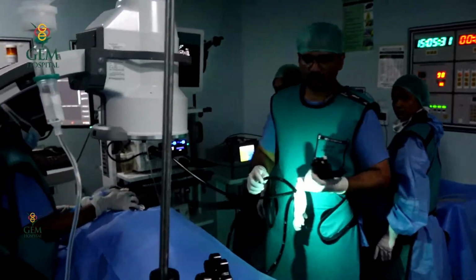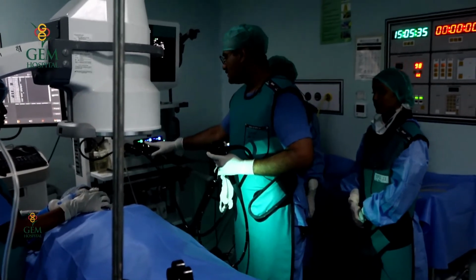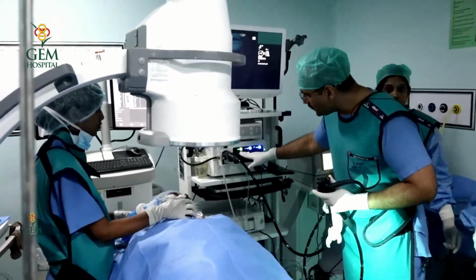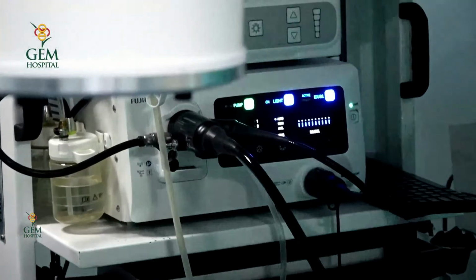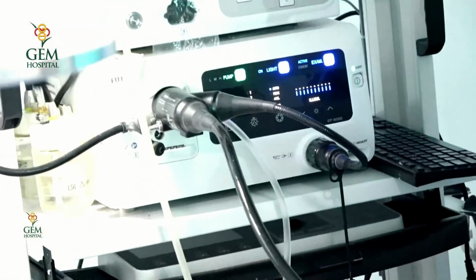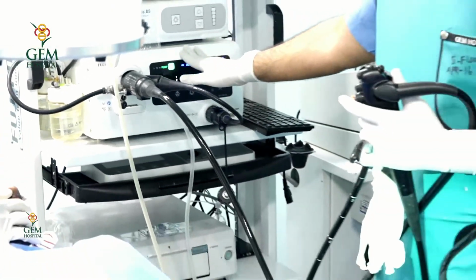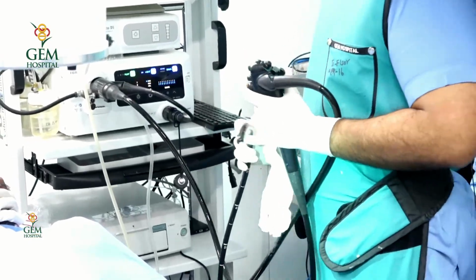So we are using the Fuji system here. If you can see here, this is a 6000 series scope. Can you see the system here? This is a Fuji system 6000 series, and the scope which we use here is a 580 XT scope. This is a 580 XT scope from Fuji, and this is the 6000 series processor which we are using for the ERCP case today.